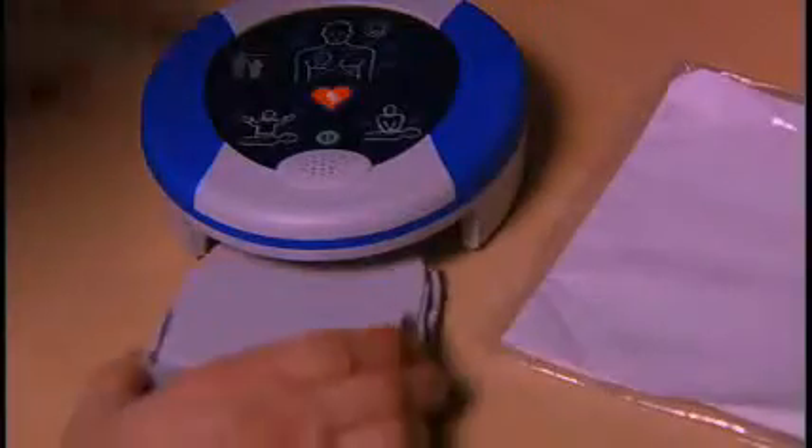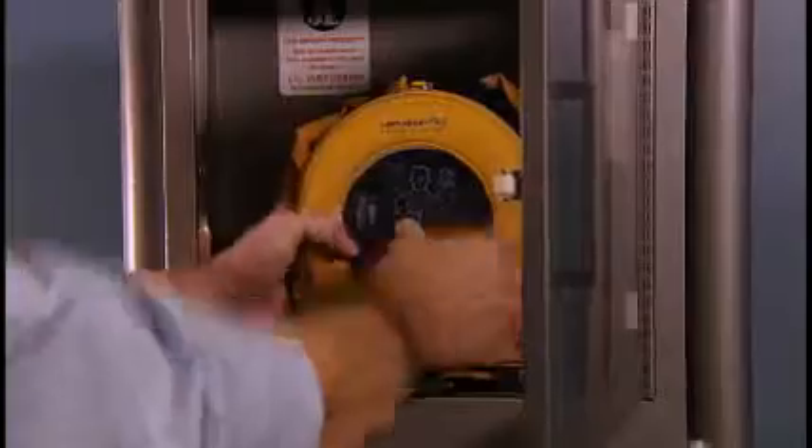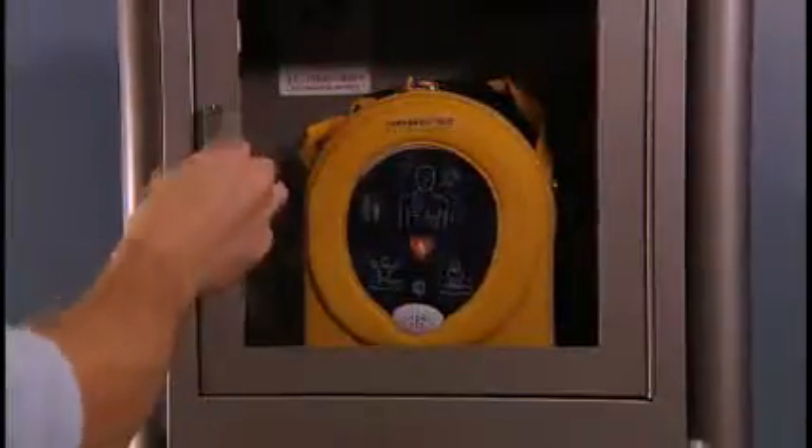To remove the pad pack, squeeze the tabs on the pad pack and remove. Once the pad pack is installed, place the Samaritan PAD in the case provided. The unit is now ready when you need it.